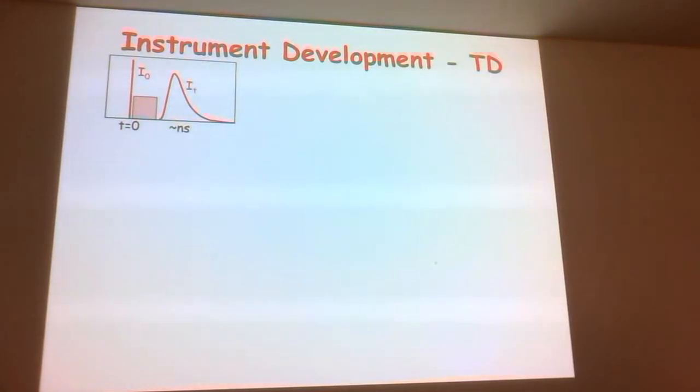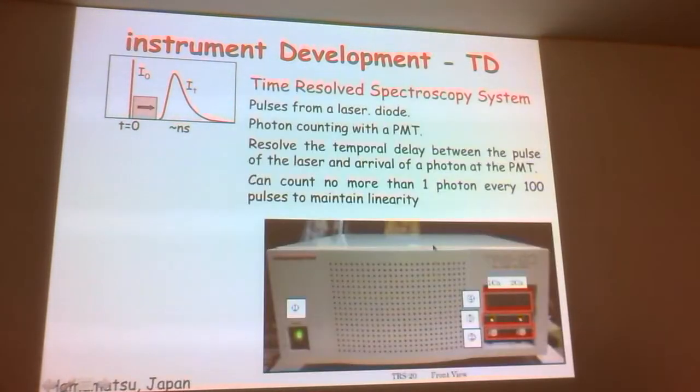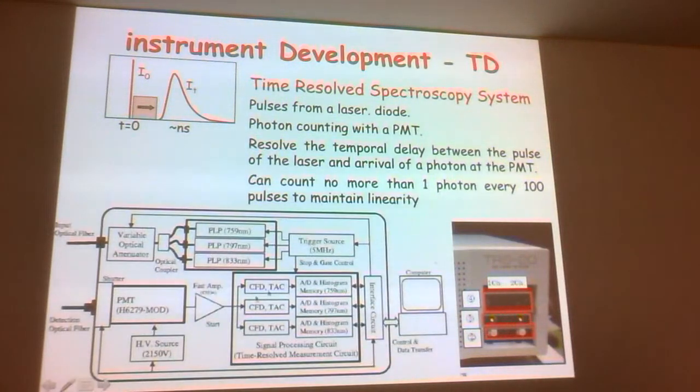That time domain system, they call it a time resolved spectroscopy system. So it's typically one source, one detector. Every detector needs this circuitry behind it. So if you wanted to have dozens of detectors, it would get expensive pretty quickly.